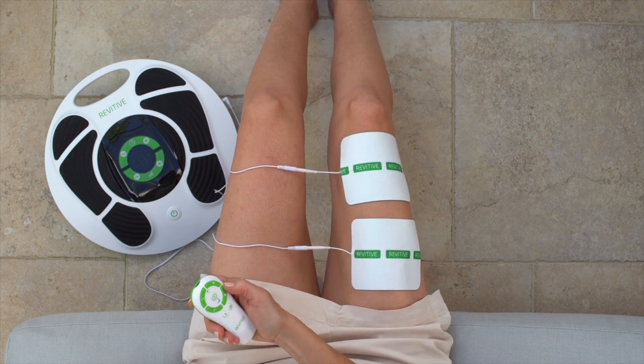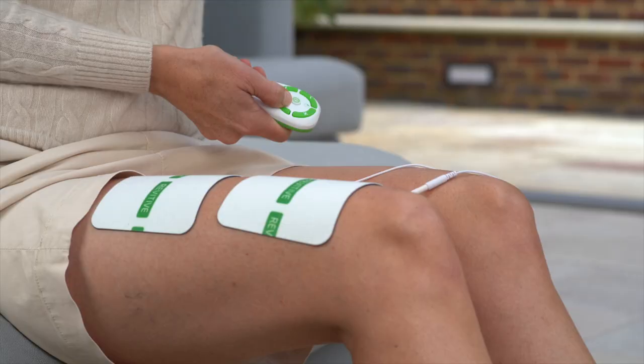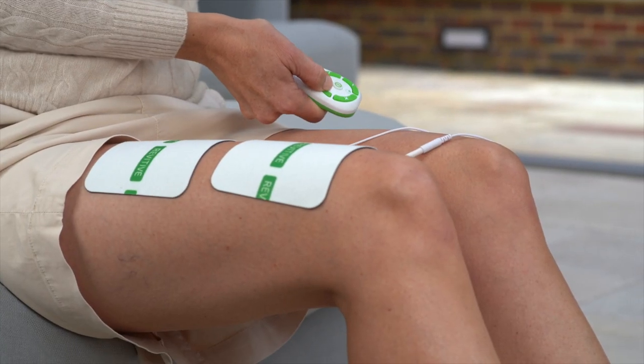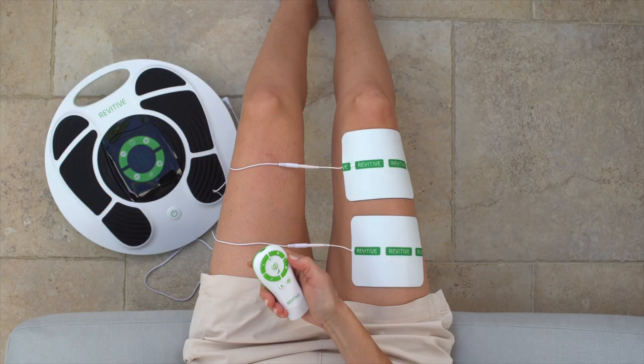For the remainder of the 20-minute session, you will feel 10 seconds of stimulation followed by a 50-second rest period. This then repeats. We recommend using the arthritis pads on the affected leg for 20 minutes once a day, 5 days a week.